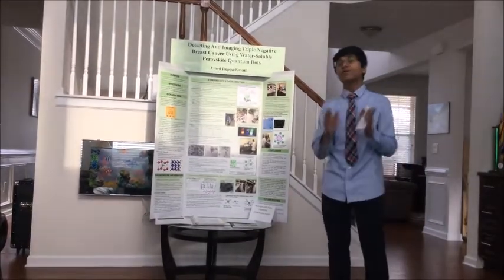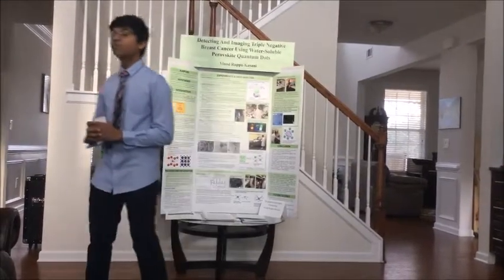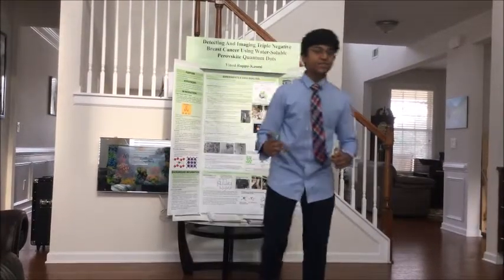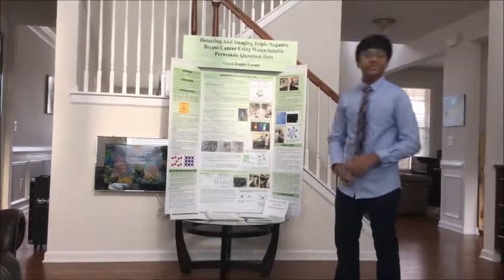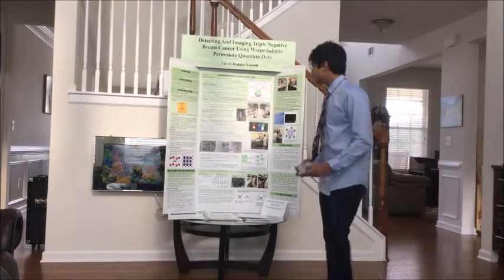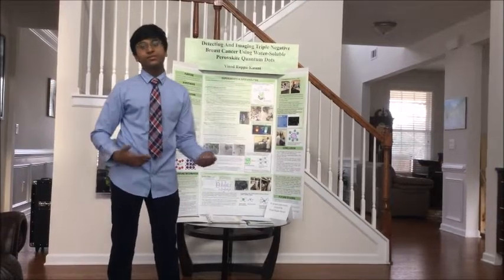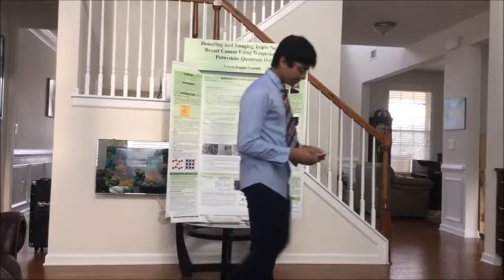I chose the perovskite material because it has an extremely high photoluminescent quantum yield, which means the amount of photons that enter the perovskite substance is almost the same as the photons that exit it as luminescence. Because of this extremely high quantum yield, I need a very bright color to actually know if the exosome is present and if the sample actually has triple-negative breast cancer in it, right?